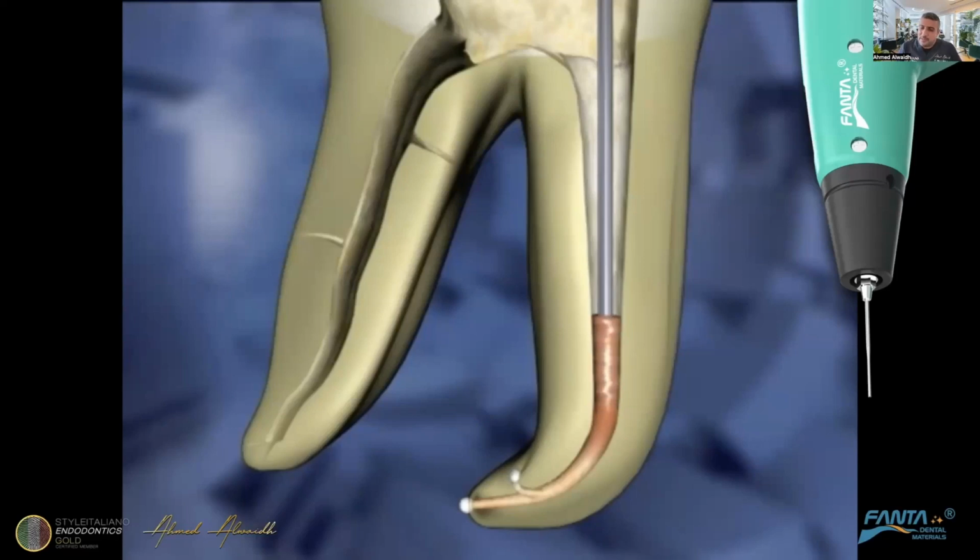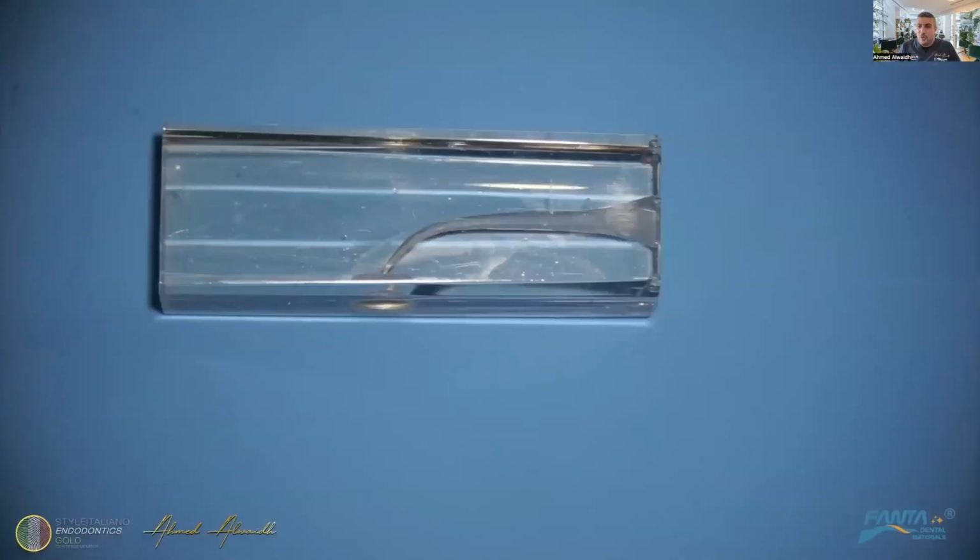Then we eject the gutta-percha for a few millimeters, then take out the gun and we put the plugger, and then we condense. It is better to do portion by portion to prevent high shrinkage. And then this is the middle part, and then we will go to the coronal part. This is the same until we finish the canal. So this is a demonstration of how we're going to obturate a canal with the continuous wave of condensation.